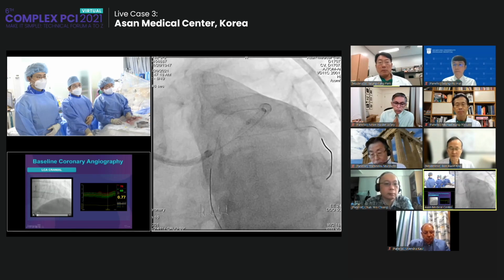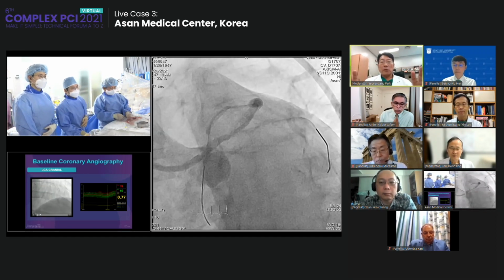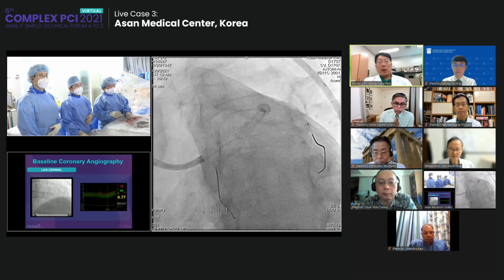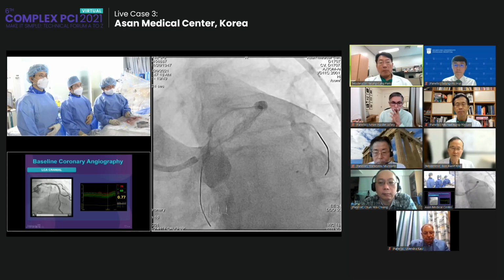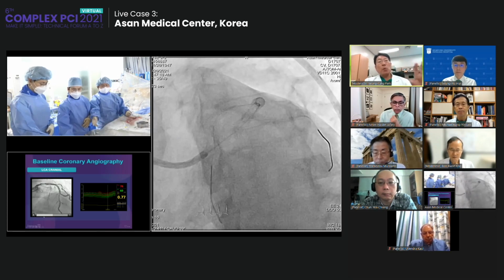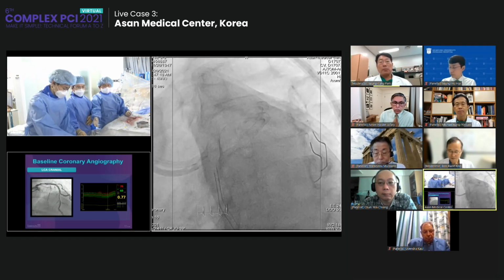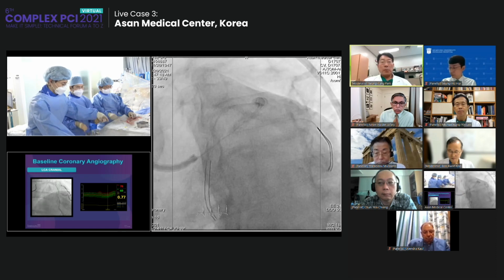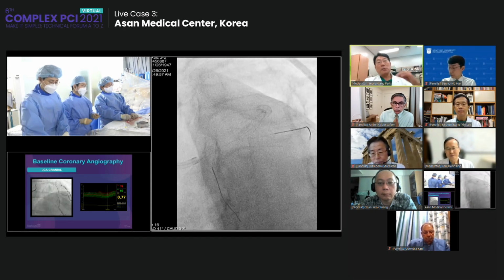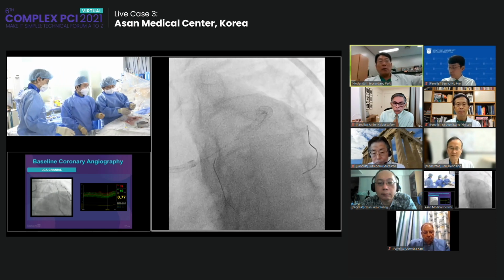All right, great. So you compare the difference of the distal to the proximal FFR value itself, right? Proximal is greater than the distal part, the difference 0.18, and the distal part is 0.15. So the first part, the delta FFR difference is 0.18, a little bit bigger than the distal part.